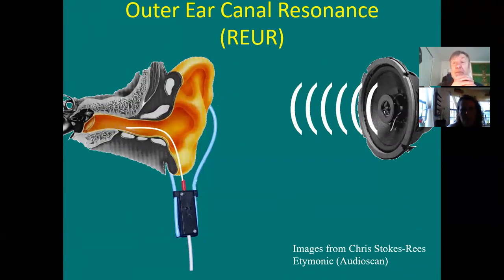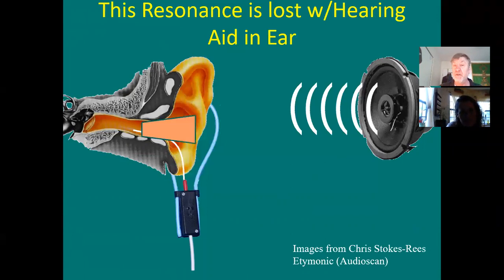This I will tell you, the tube is not close enough to the eardrum. Okay, it's too far away. But here we go. So here's real ear unaided response. The next slide is hearing aid, real ear aided response.